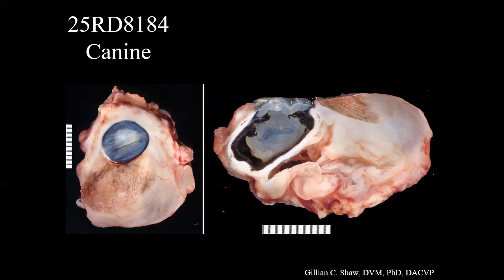So they say it has been drained twice earlier this year. Clear fluid returns quickly. An MRI in March 2025 showed no other areas of concern. So I think because of this recurrent swelling, they just decided to enucleate.